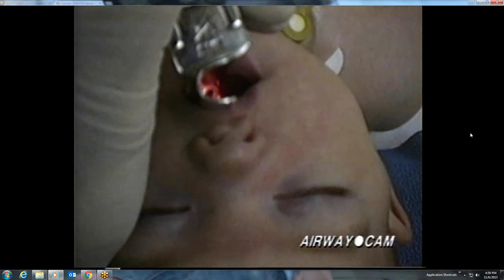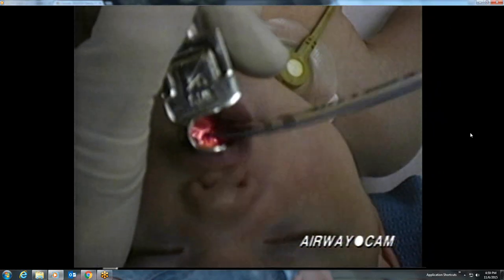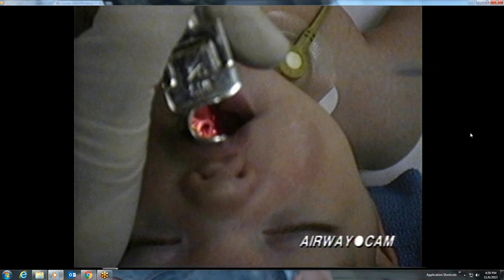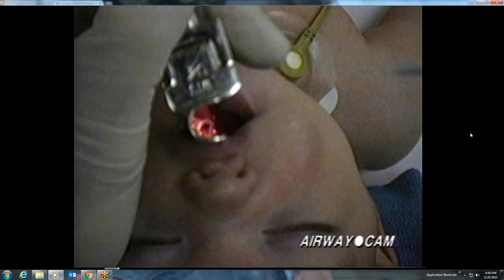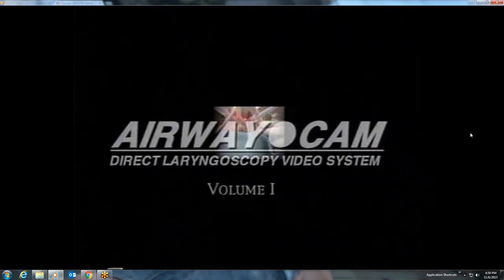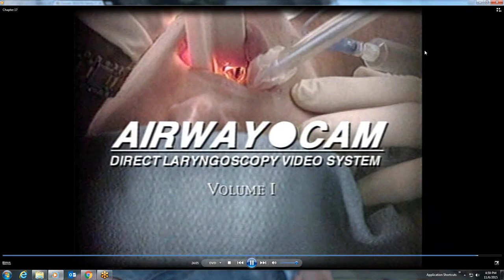Our final laryngoscopy is on a one-month-old infant with a small Miller blade. Although the structures are much smaller, the fundamental technique is the same: tongue control, landmark identification, laryngeal exposure. A cuffless endotracheal tube is carefully inserted. The infant epiglottis is relatively large and horseshoe-shaped. The posterior cartilages are also relatively larger in the infant. Even though the straight blade is being used, the tip of the blade must be in the vallecula, because otherwise the epiglottis would not be seen. This concludes Volume 1 of the AirwayCam video series.